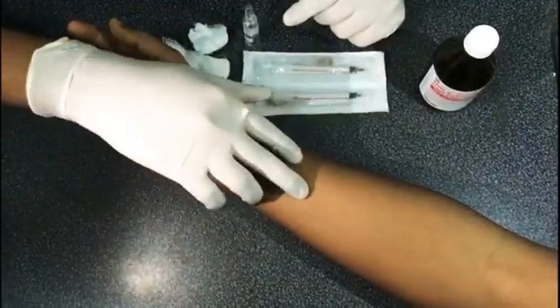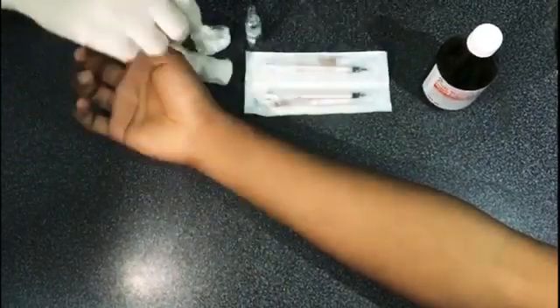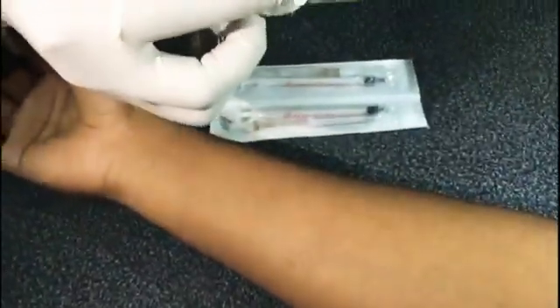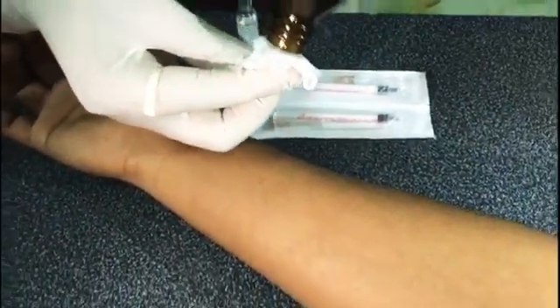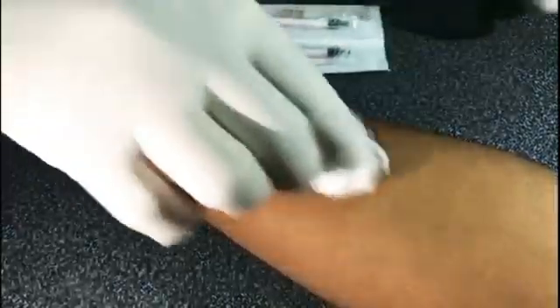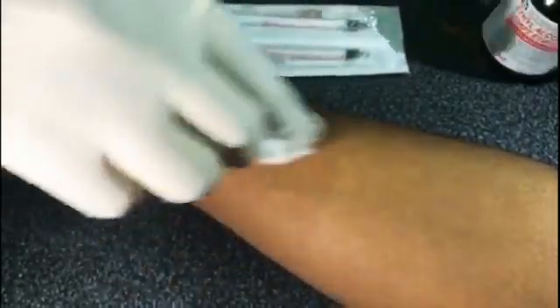Make sure that you wear gloves yourself. Now we are going to sterilize the patient's skin. We need to sterilize the area of the injection site, so clean the site thoroughly with a piece of cotton.